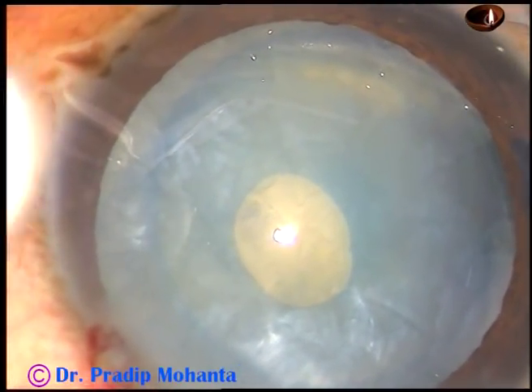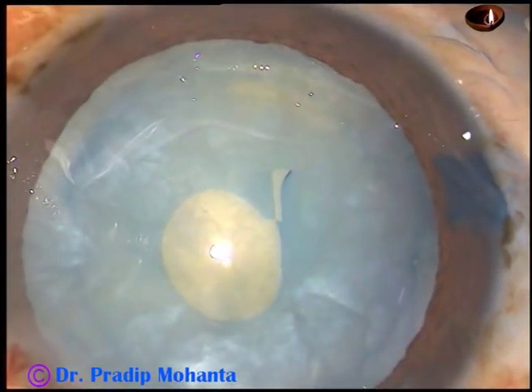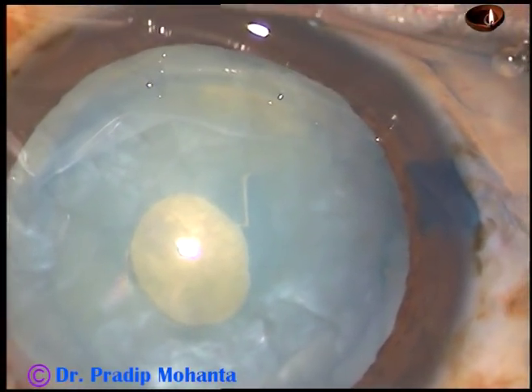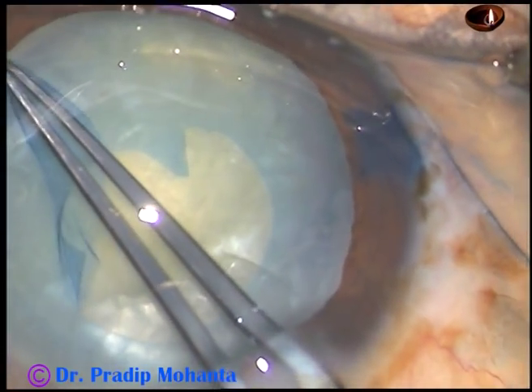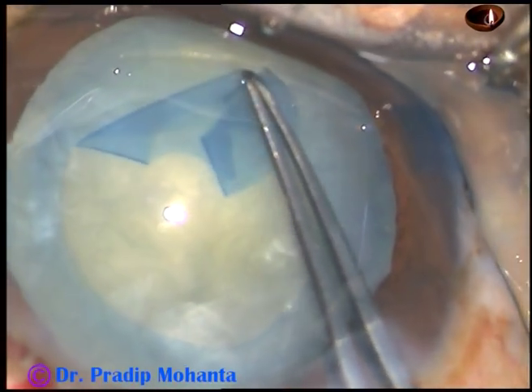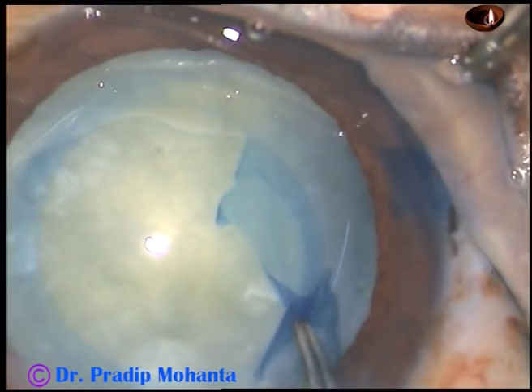And now inject visco again and take a Vannas scissor and make a cut. The tag is like this — if you hold the tag in front, you will not be able to move it. So you have to hold the tag on the right side and go clockwise. Because the tag in front will not move. Now go clockwise all around and enlarge this mini rhexis into an optimum sized rhexis.